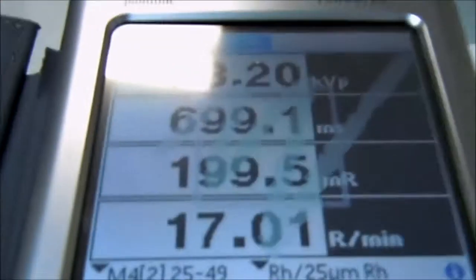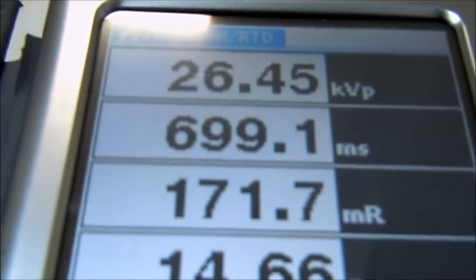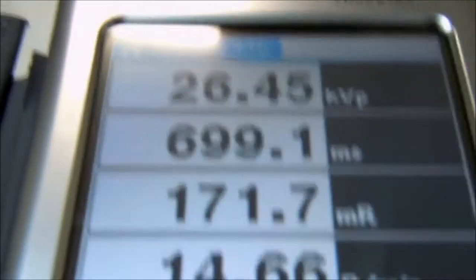Take another shot. Set it to 25. Detector's reading it, and now I get 26.45, which it should be within plus or minus 2 KV.